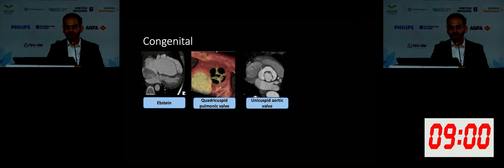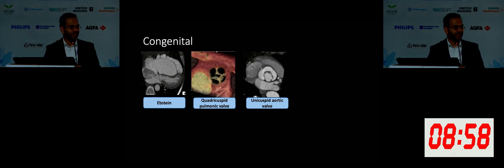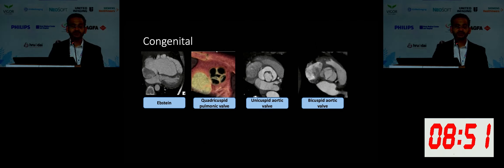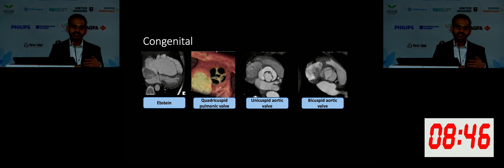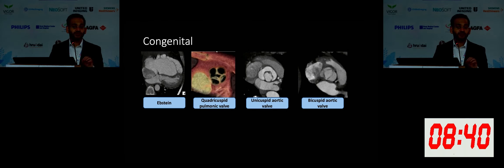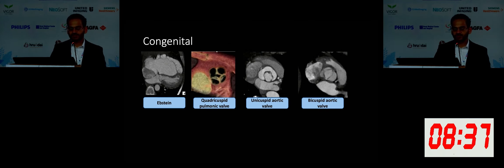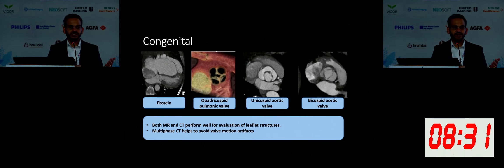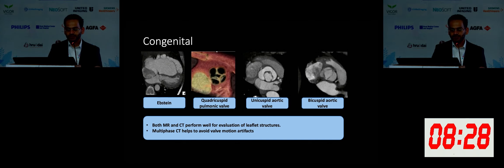Another congenital example is unicuspid aortic valve, where you don't see the normal tricuspid appearance but rather a unicuspid type of appearance. And then you can see bicuspid aortic valve, which is by the way the most common congenital heart disease. For every single coronary CT that we read, we tell the fellows to make a double oblique short-axis view of the valve at that level so you don't miss the bicuspid aortic valve. You're looking to see how many leaflets there are, and note that because the valves are moving, you need more than one phase to reliably assess for that.